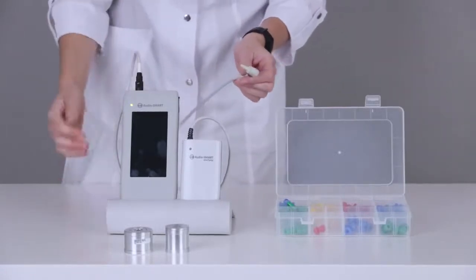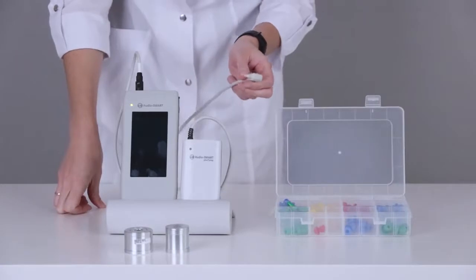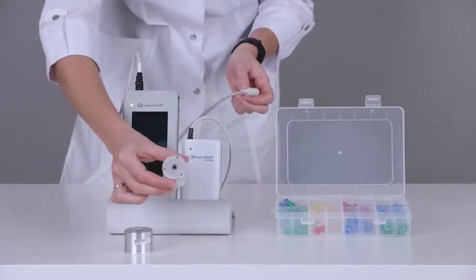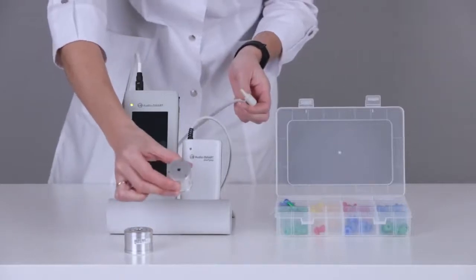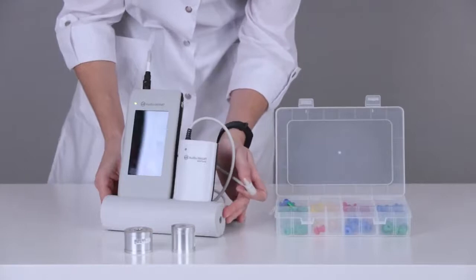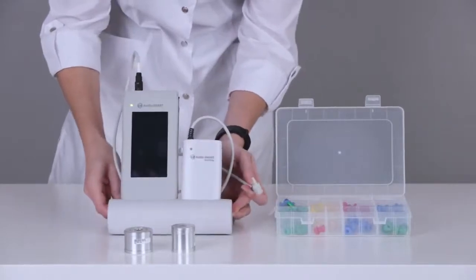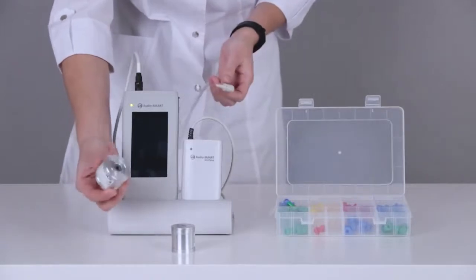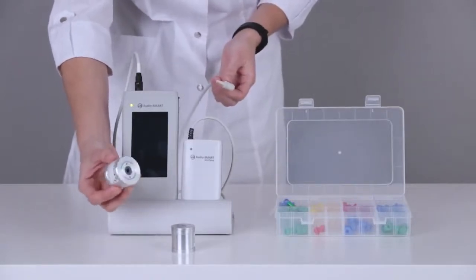Before starting work with the device, we need to perform daily calibration using such a type of test cavity with a volume of 2 milliliters or the integrated cavity in the holder. To calibrate the acoustic reflex coefficients, we will use the big size cavity.